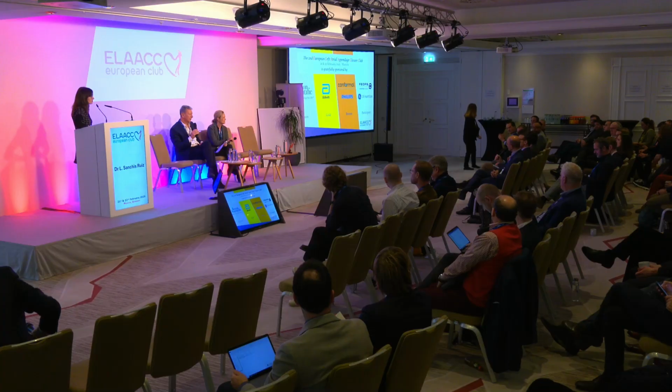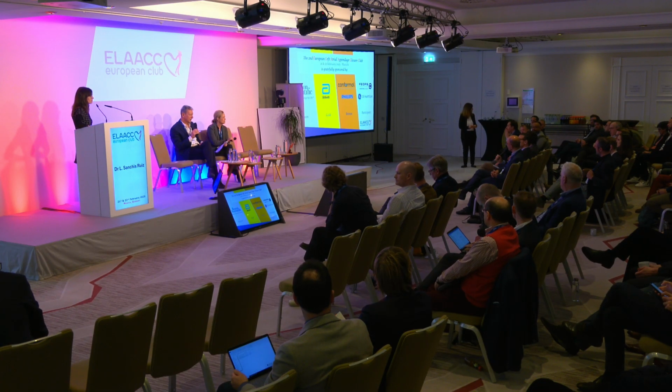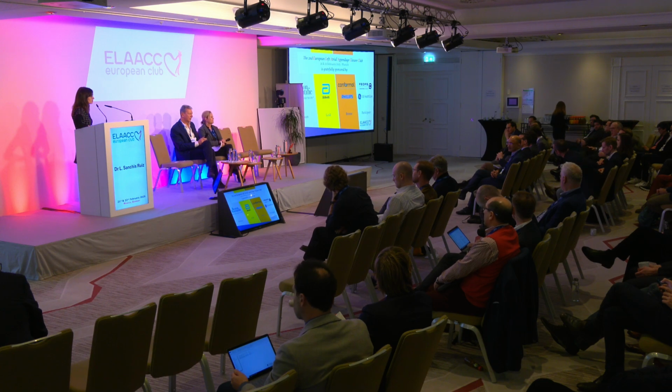Thank you so much. Very excellent imaging provided. It's really, I think, a good way to go. You mentioned multiple use. What does it exactly mean? How fragile is the probe and what's the cost? Well, in theory, it's smaller. In our case, we only use it for the echo lab, so it's not for everybody.